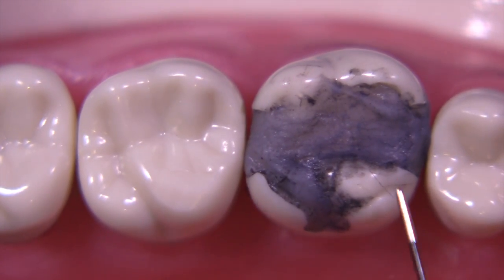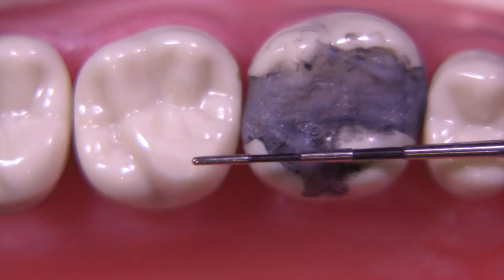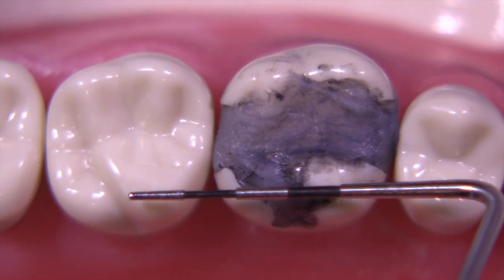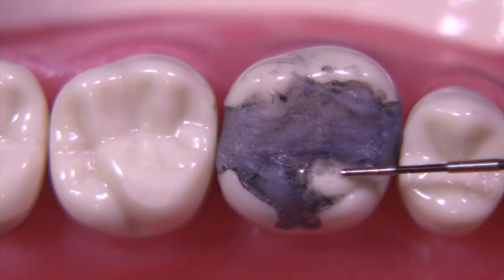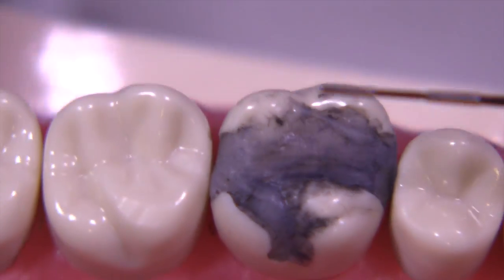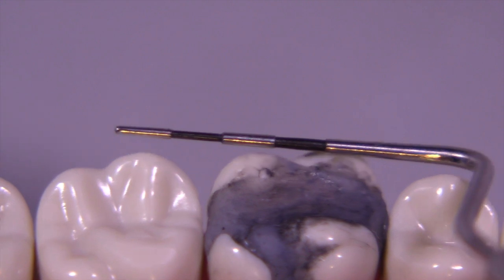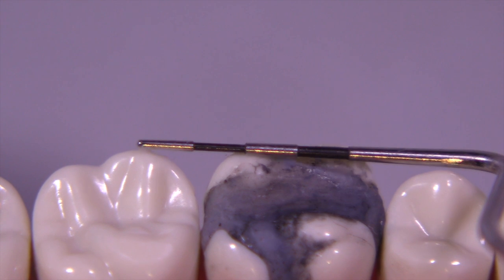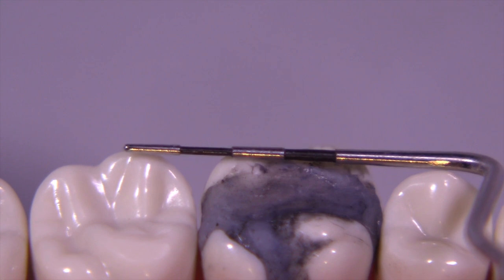Let's take a look at the marginal ridges, make sure they're level, and the embrasures are all going to be duplicated. The lingual cusps will line up with each other quite nicely, and when we're finished we're going to want our lingual cusps to do the same. Drawing our attention to the facial side, we're going to be replacing maybe the mesial facial cusp, and we'll want to determine the height of that cusp when we're finished prepping and placing amalgam - it's going to be pretty tricky.